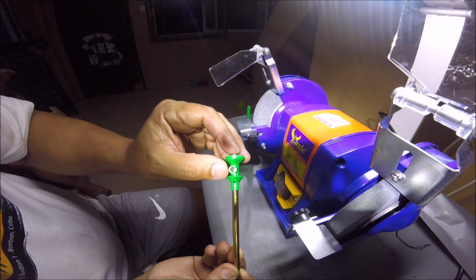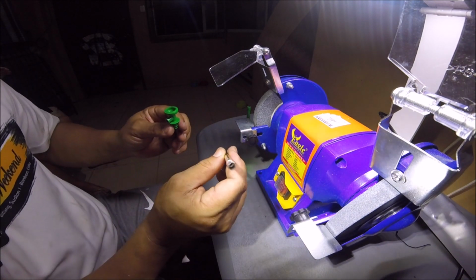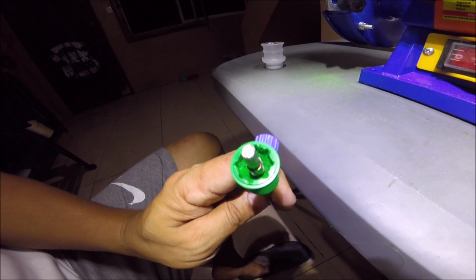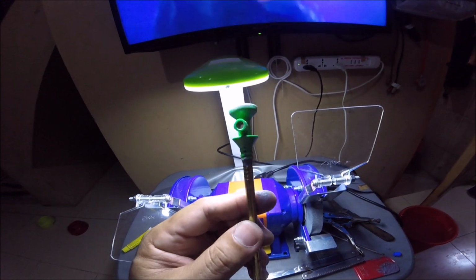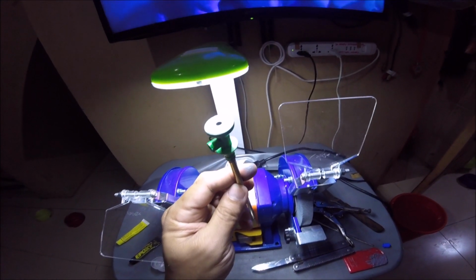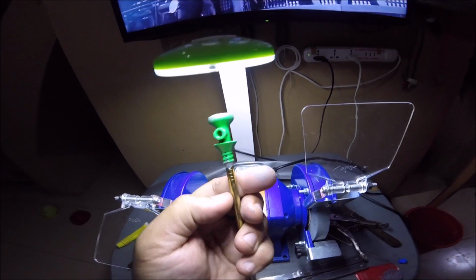So I can put the saline tube here, and the saline tube will supply water and come out here since there's space between the inner diameter. Whoa, what was that? And I'm going to put epoxy on top, but I created the ridges and rough surfaces first so the epoxy grips well. You can see the light shining through inside. See, that's my cavity now, my water port. Okay, and that's my top, my bottom. So all I need to do now is put a holder for the Layla retractor.